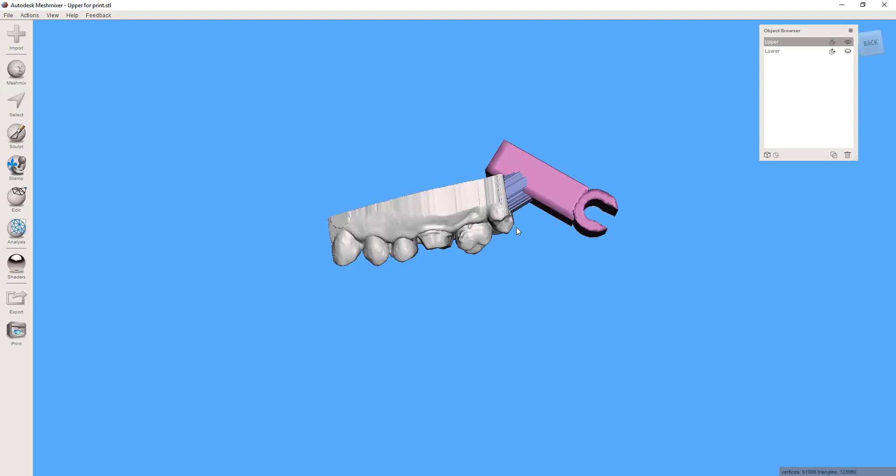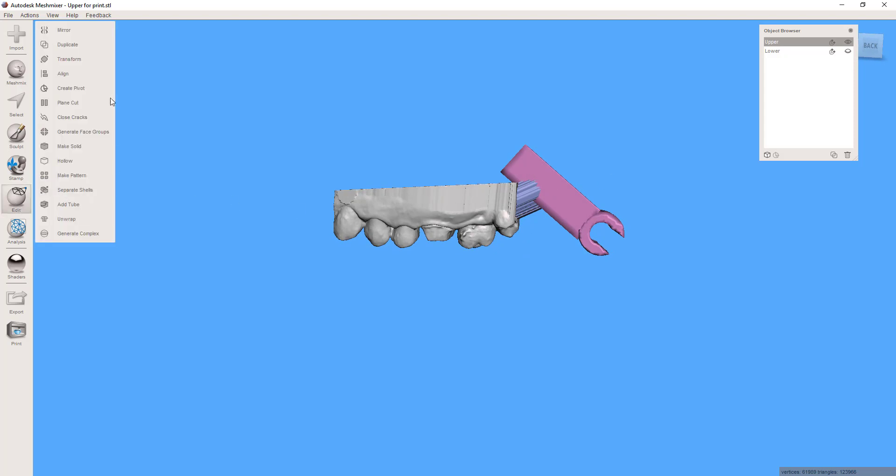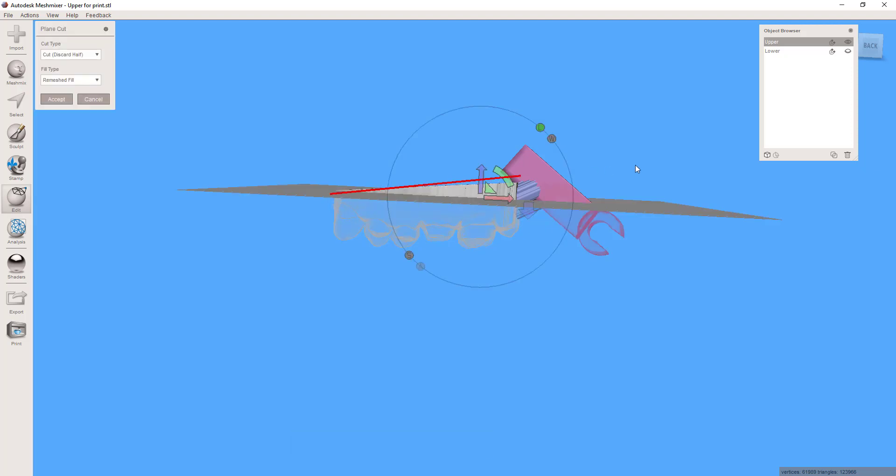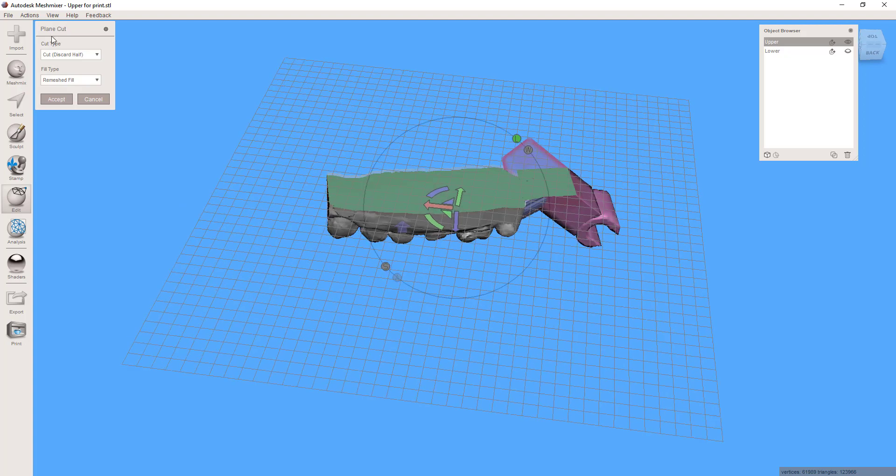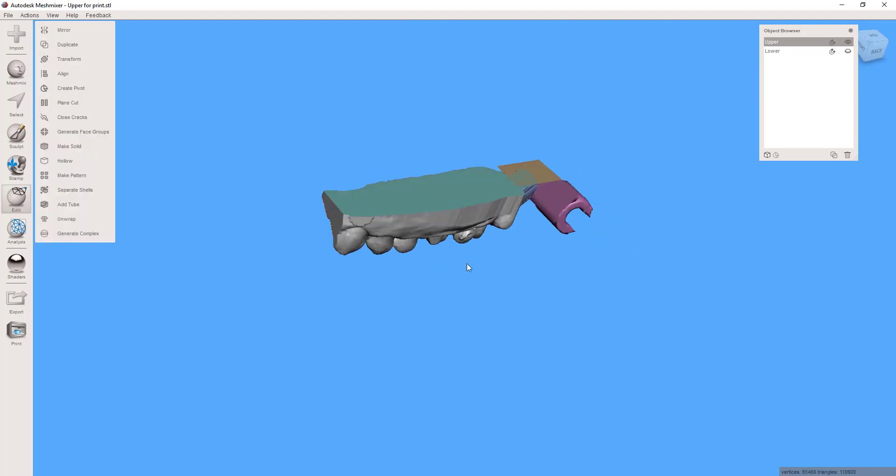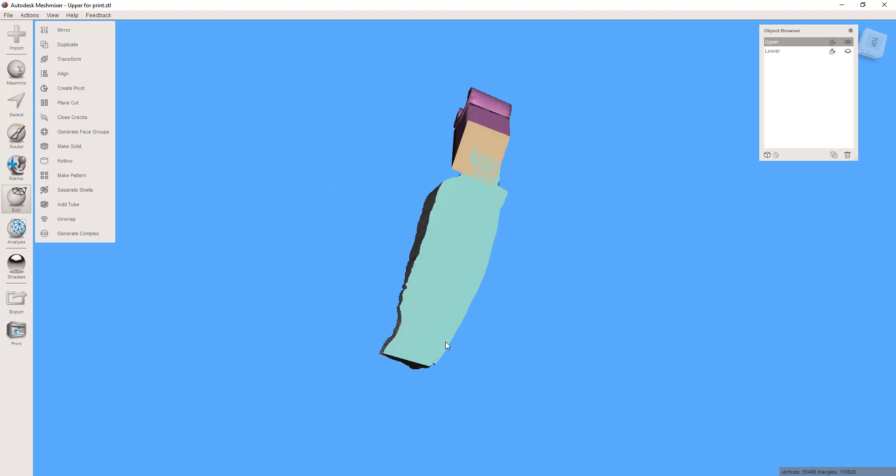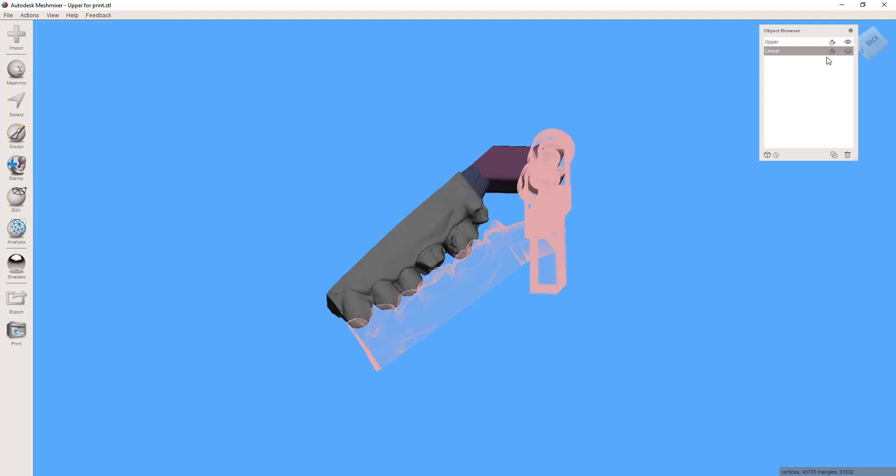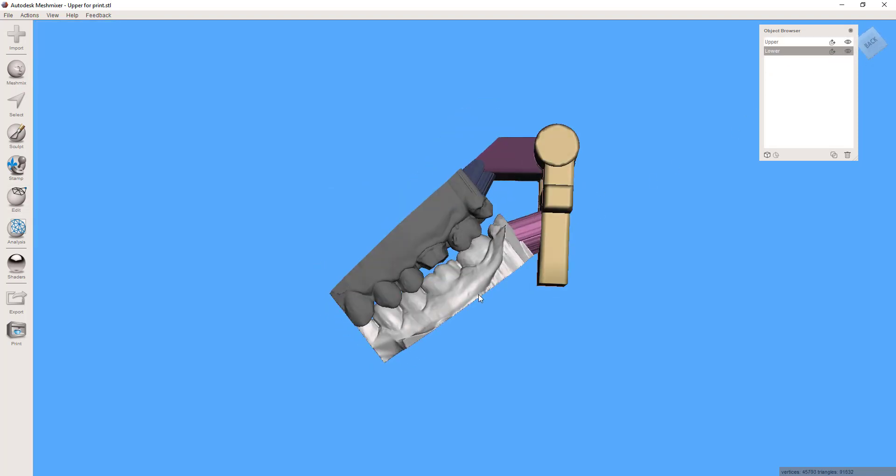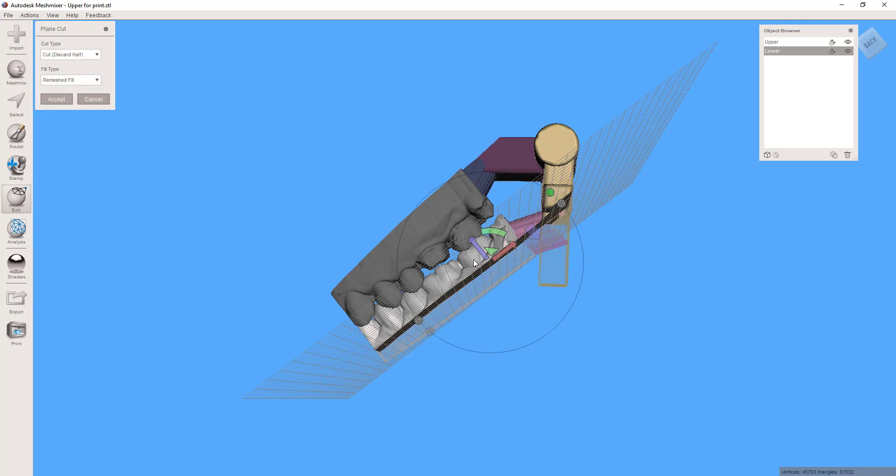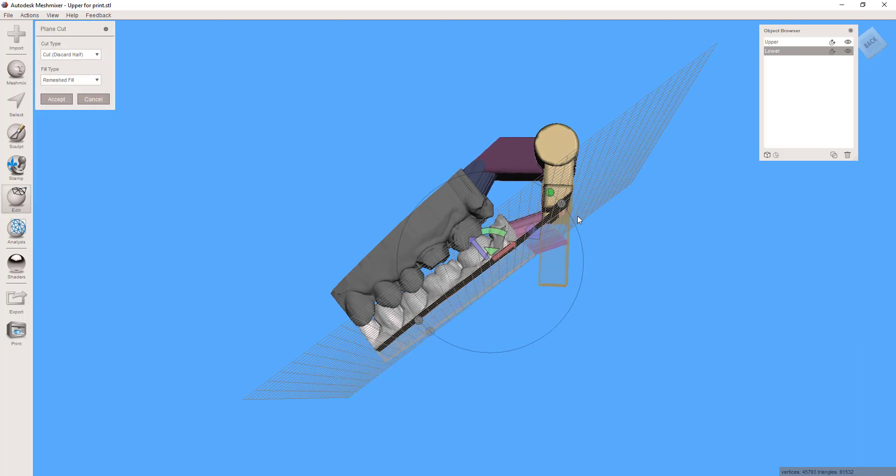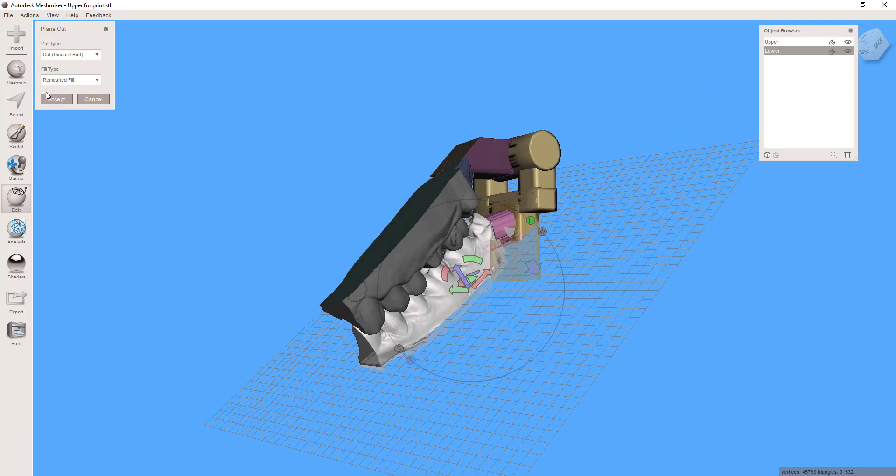The last modification that you might want to make, and this is certainly optional, if you print this it's clearly going to have to use supports. I like to print without supports whenever possible, so simply coming across here with a plain cut we can now put a flat base on this entire portion of the model and the hinge. And then repeat the process on this lower, so edit plain cut, and there we have it.